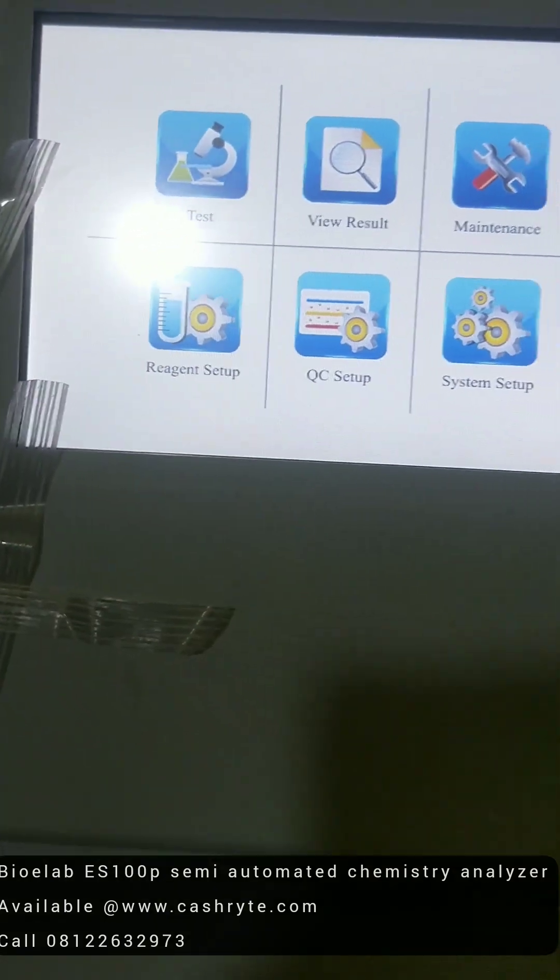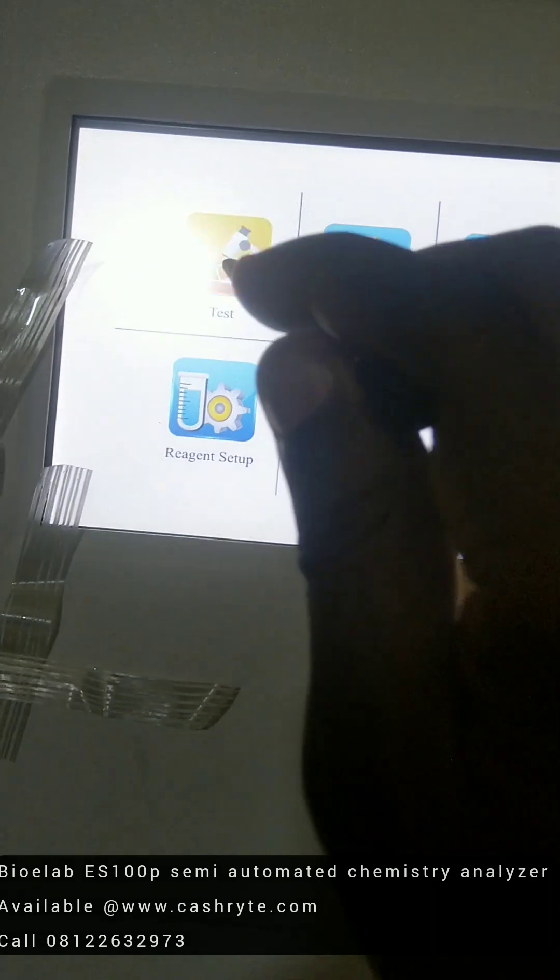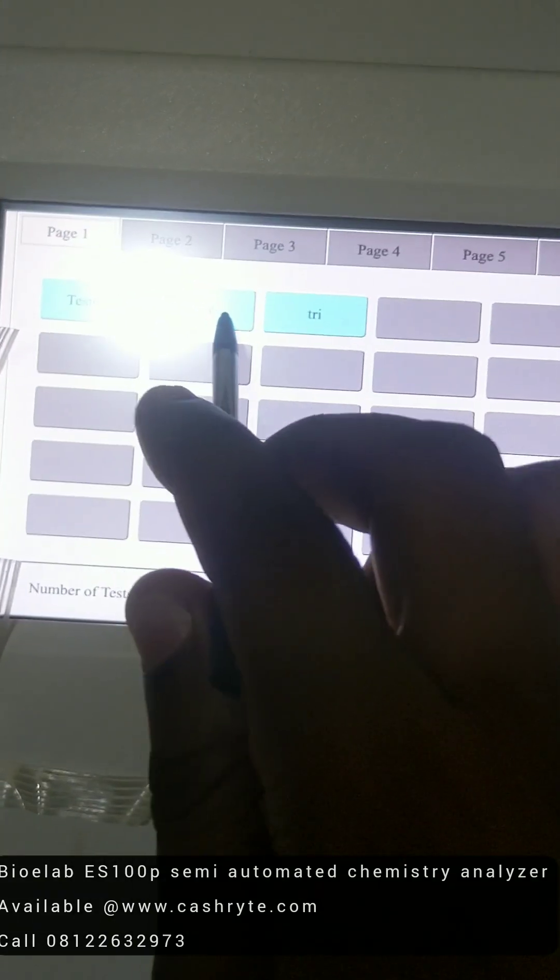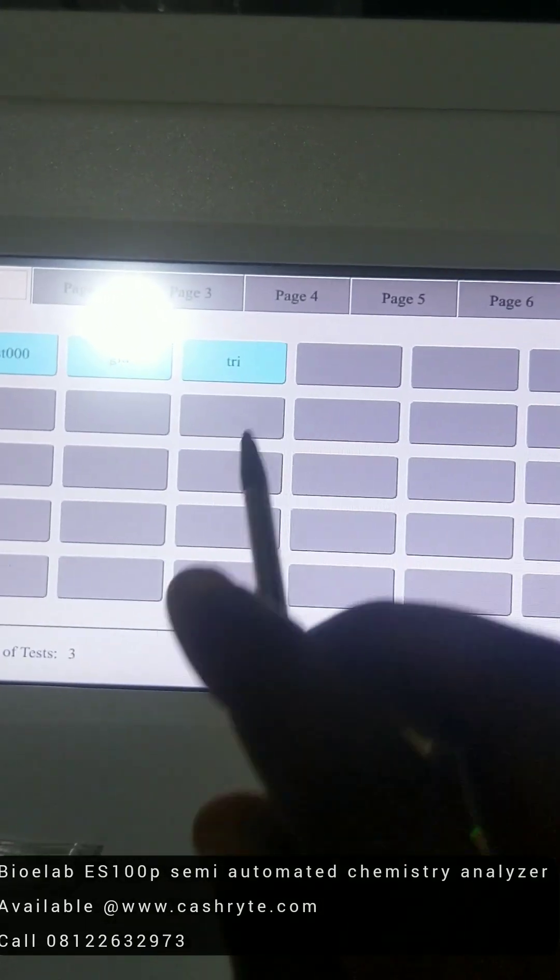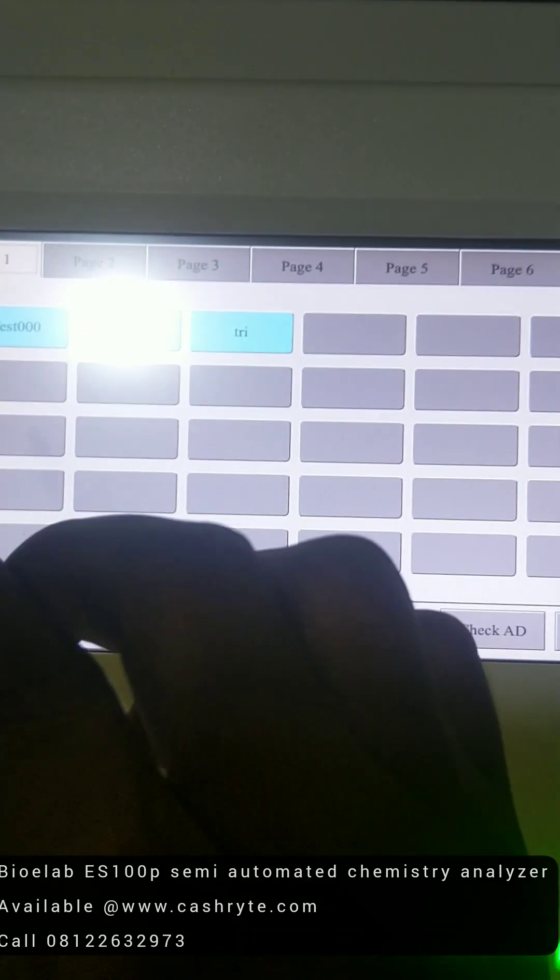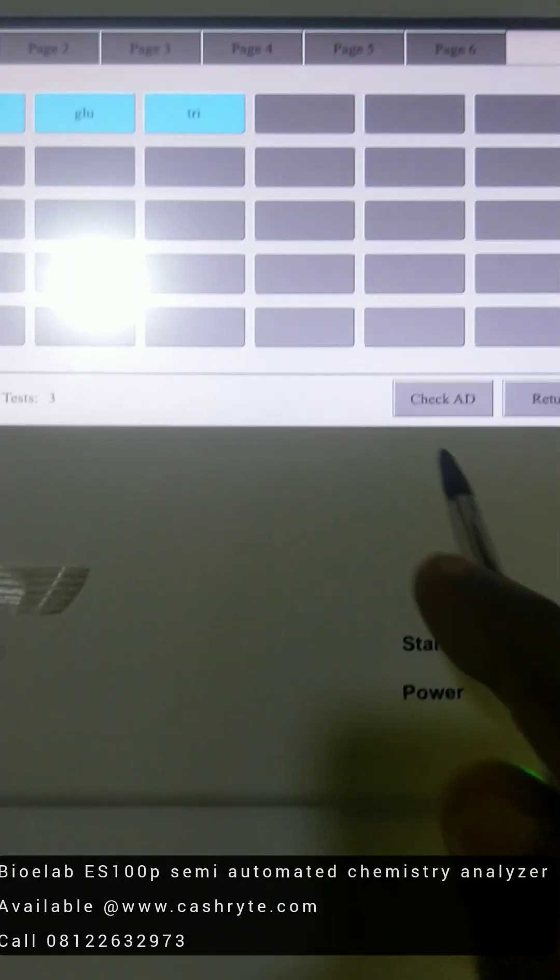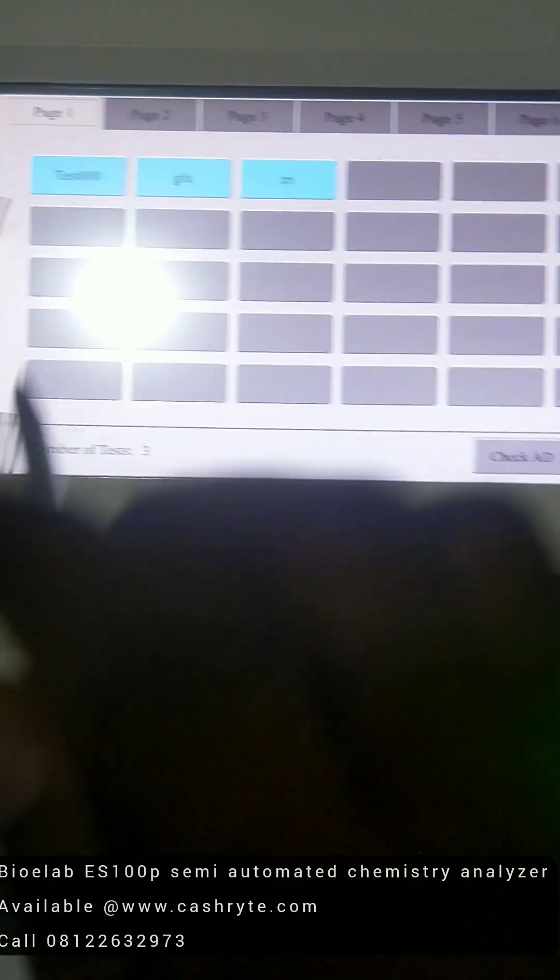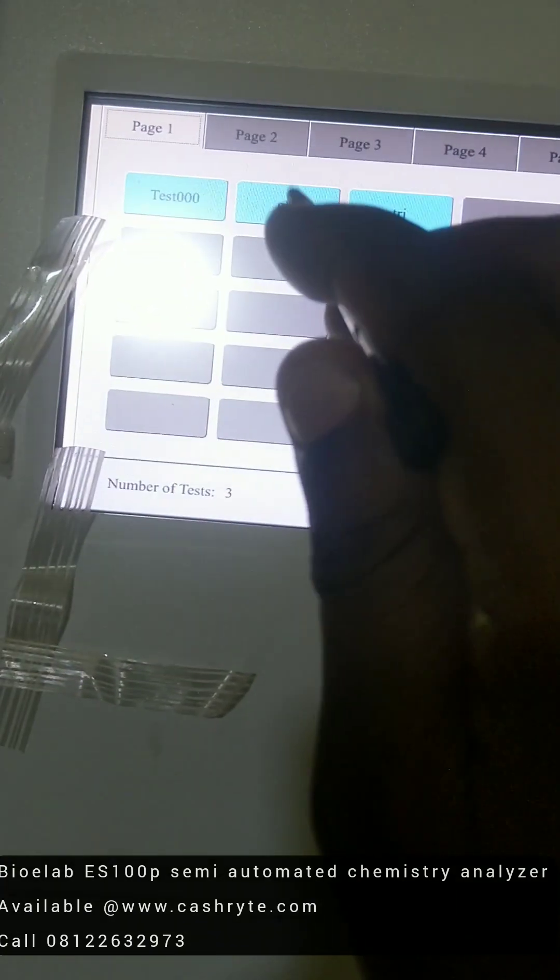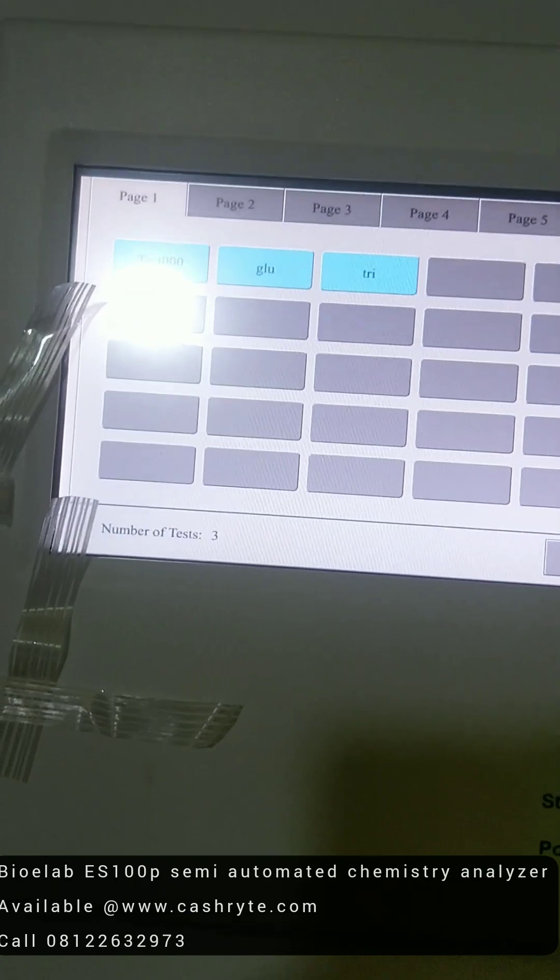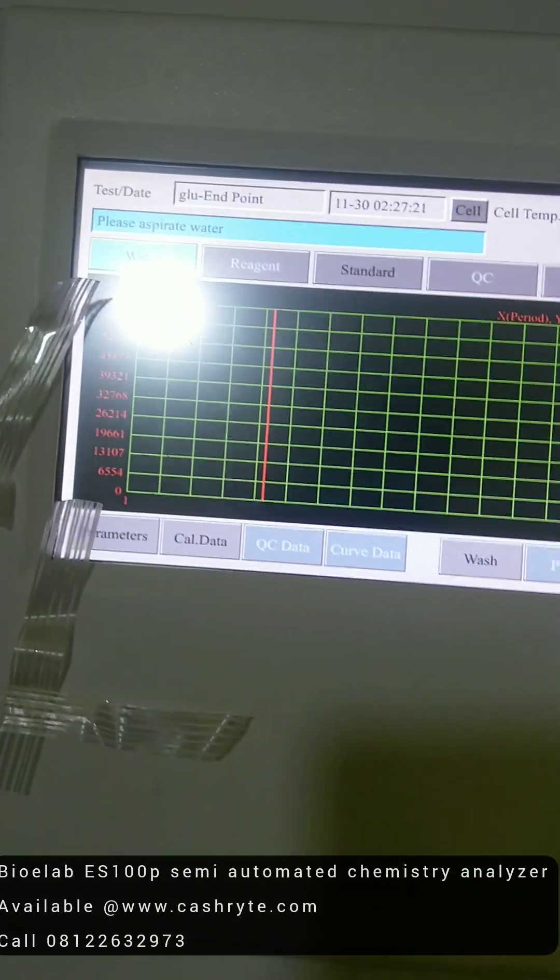So you go back to if you want to run a test. You click on test. You can see we have glucose here, we have triglyceride. So the more parameters you add, the more they keep showing in each of these boxes. So if we are to do glucose tests, what you do, you click on glucose.